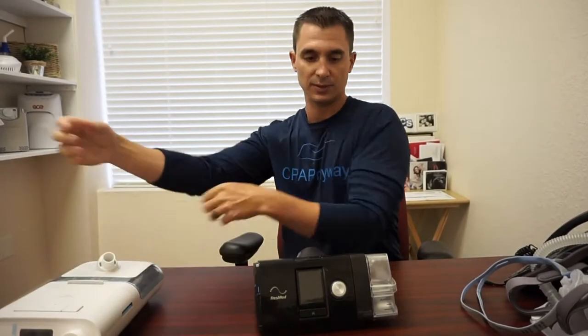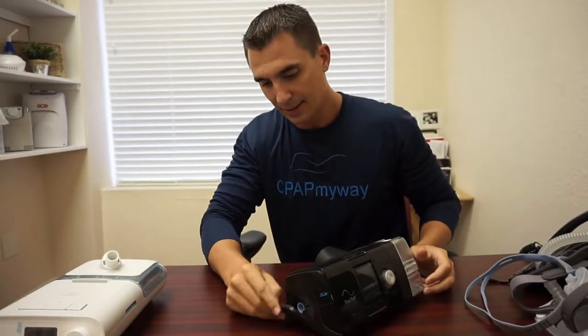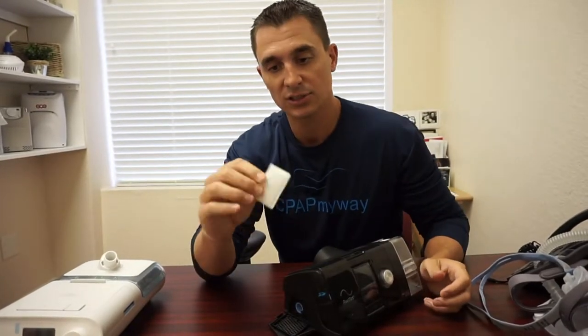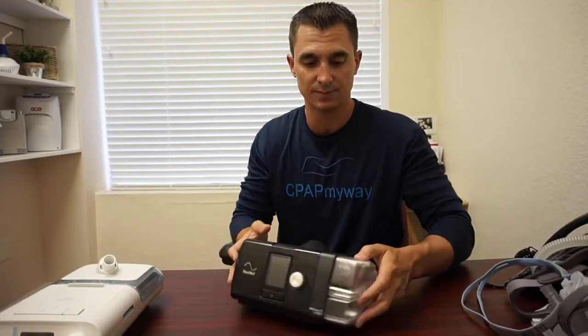Looking at the ResMed AirSense 10 here, just for demonstration purposes, it has a very similar setup as far as on and off and all that. On the side, you have just a disposable filter on this particular unit — so nothing to wash. Just take it out every two to four weeks, throw it away, put a new one in, and clip it shut. Really very simple. But it can be the most crucial thing about your CPAP as far as longevity goes. You must maintain your filter.